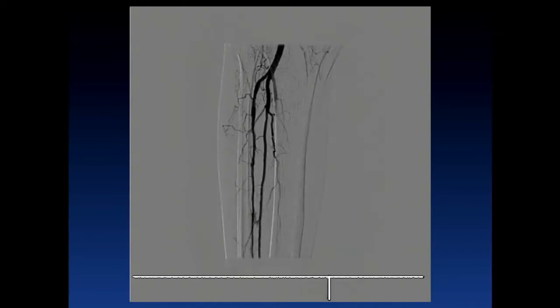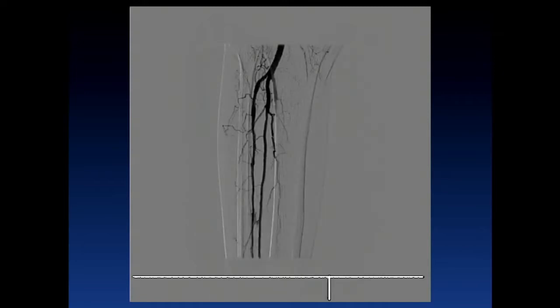over 1,000 critical limb ischemia cases at this point, I've had 2 perforations. And the other perforation I had was related to complex retrograde access and reverse CART. This was a fairly straightforward antegrade crossing. Any thoughts from the panel about what may have predisposed to this in the first place? Or just bad luck?